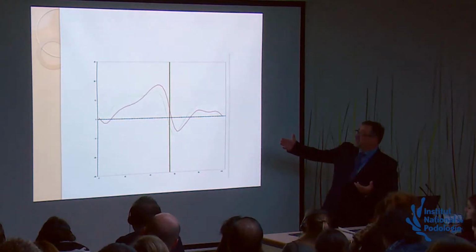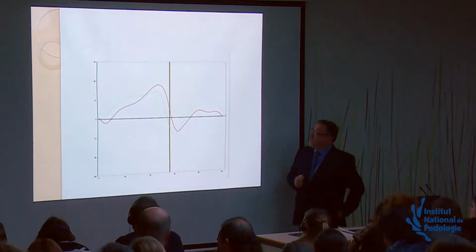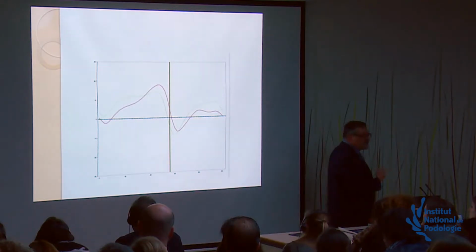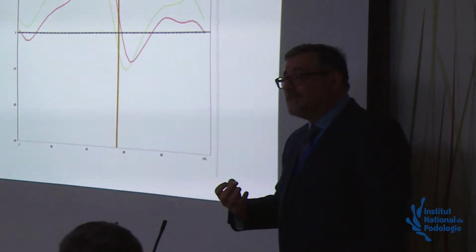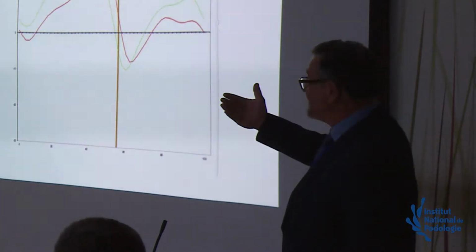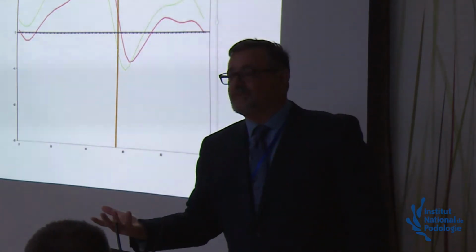Well, that is the result of his motion capture test, and you see that he's up to 20 degrees there. So this starts us to think, why do we really just depend on a static examination? While, as the previous Monsieur Lavin has already stated, dynamic function is so important.